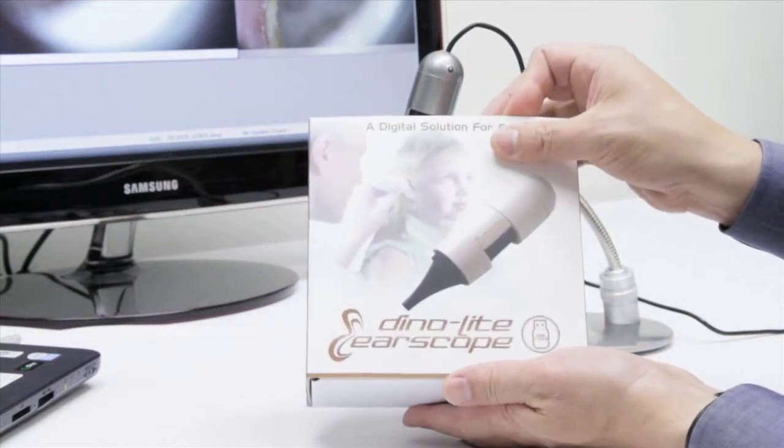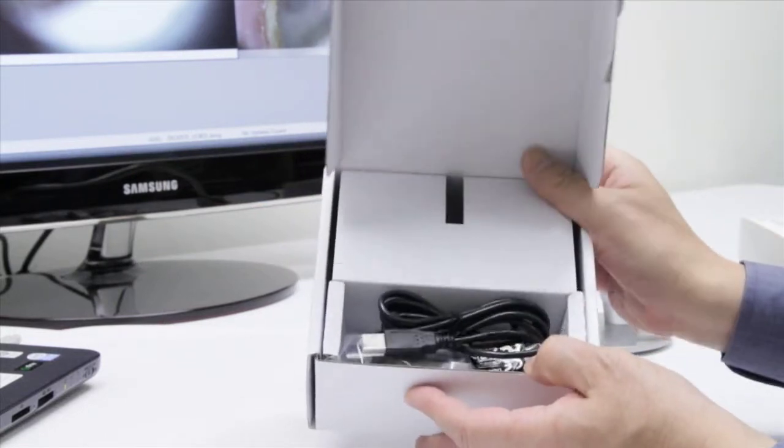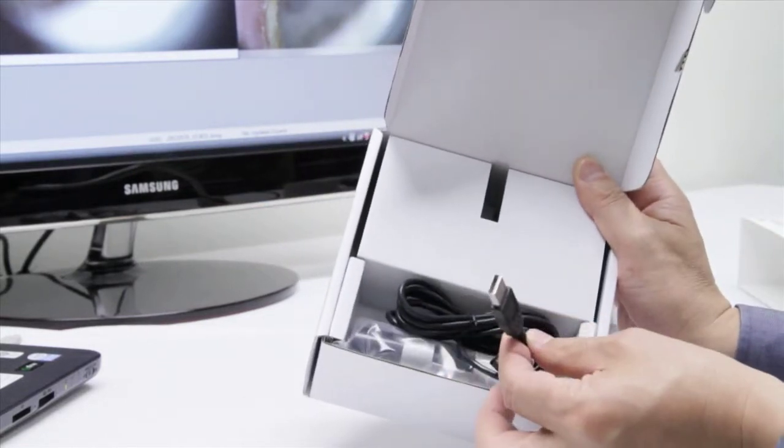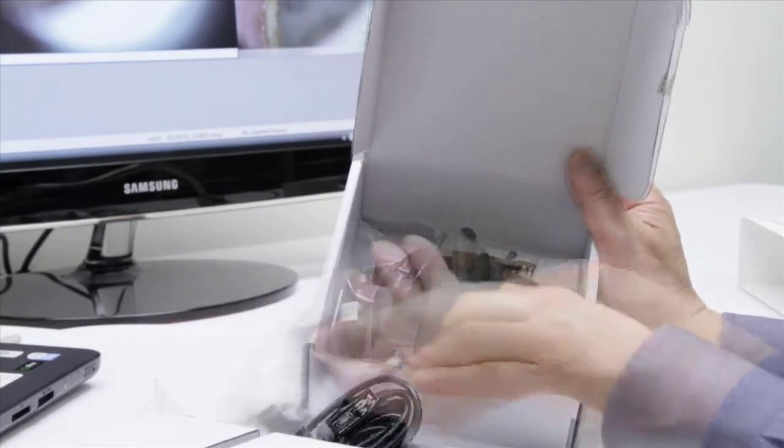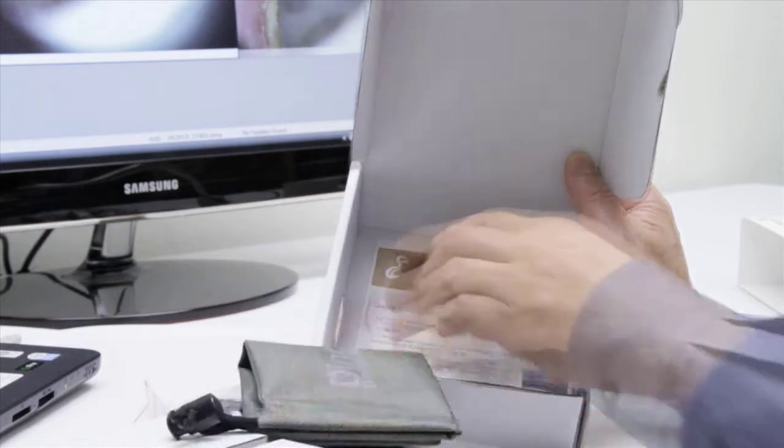Upon unboxing you will notice the unit itself as well as the USB 2.0 connection. Underneath that you have your different diameter disposable specula, a carrying bag, installation CD, as well as your instruction guides.